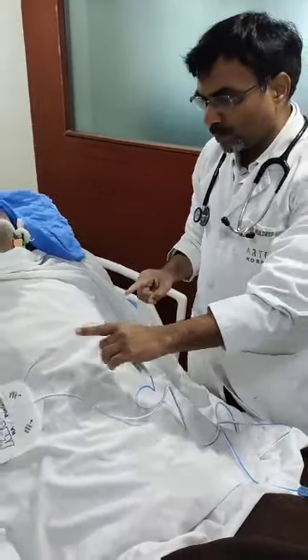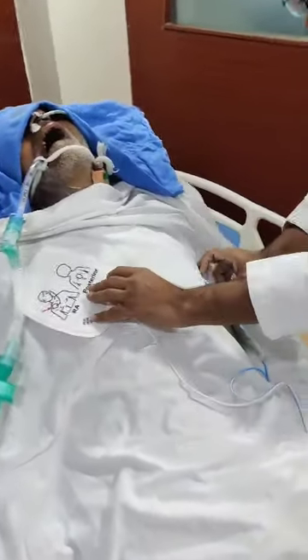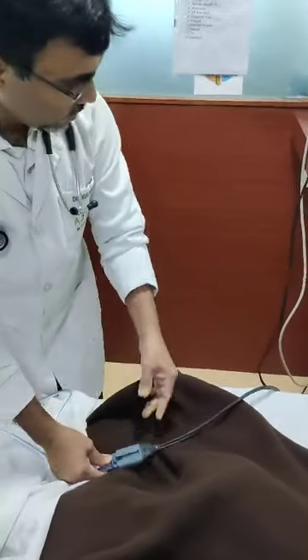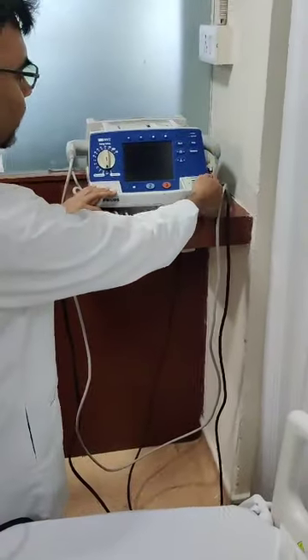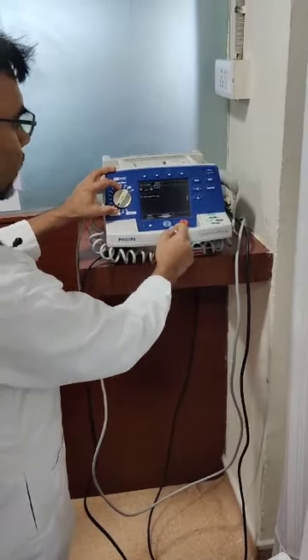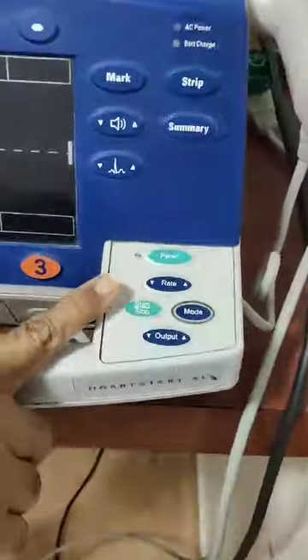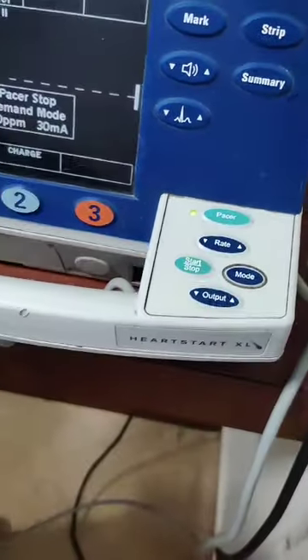For that, I'll apply the pads appropriately like this, and I'll make sure that the connections are well connected to my machine, right? These connections are appropriate. Then I'll switch on my machine, okay, and I'll go to the pacer mode. So you can see, this is the pacer. So I'll switch on. This is my pacer mode.